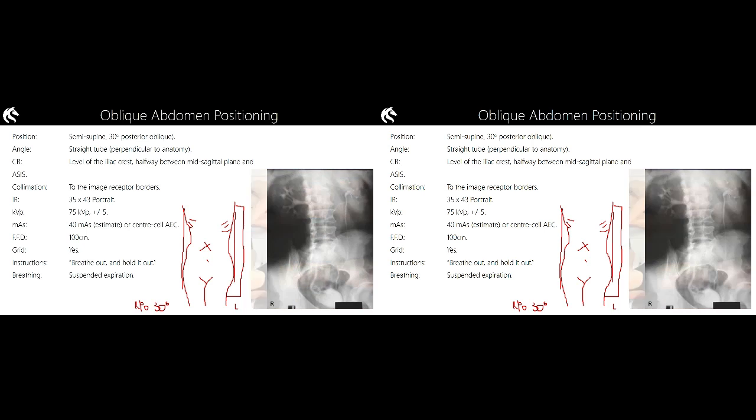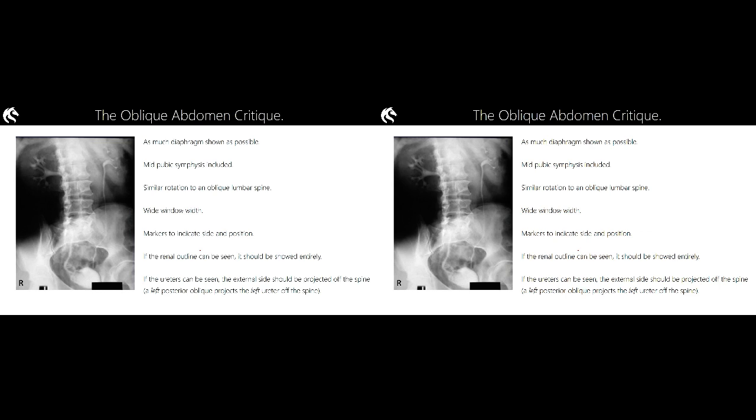All right. So, how should it look? In this particular radiograph, the patient has been given iodinated contrast. So that means that the collecting system of the kidneys and the ureter and the bladder are going to be far better visualised. This particular examination has been undertaken with greater than a 30-degree obliquity, and the reason why I know that is because the very tip of the nose of our Scotty dog on a 45-degree obliquity will just touch the edge of the vertebra. So that's about a 45-degree obliquity that the patient's been rolled into.